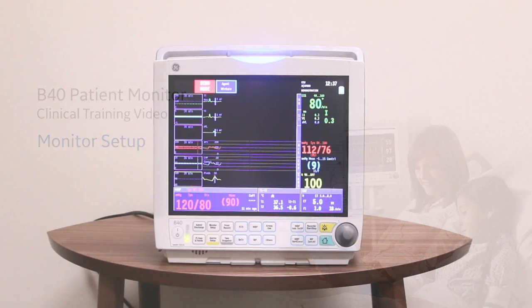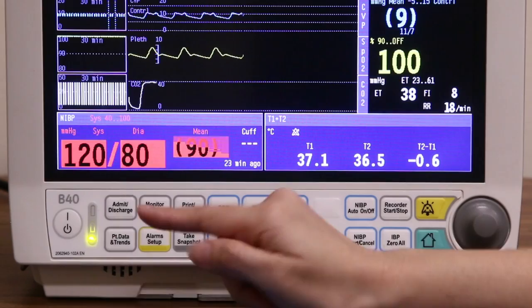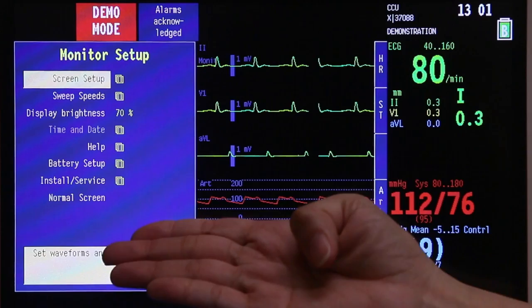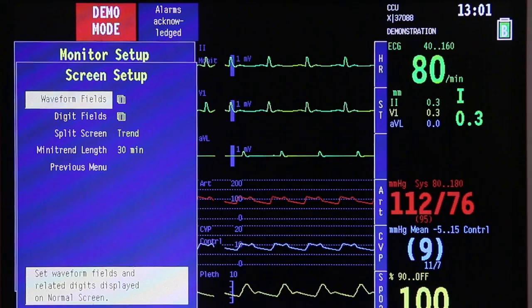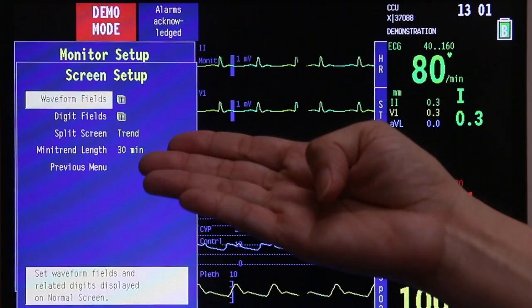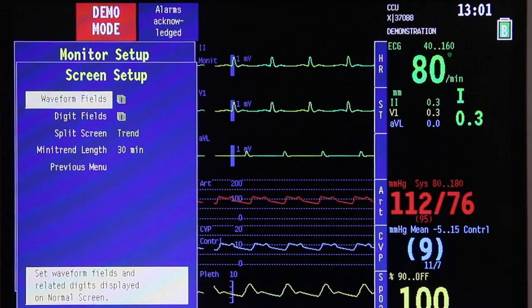Adjustments may be made to the screen manually. This menu is found under monitor setup on the main menu. Under monitor setup, you will see these options. We start with screen setup — use the trim knob and press down. So you have your waveform fields, digit fields, split screen, mini trend, and then the previous menu.